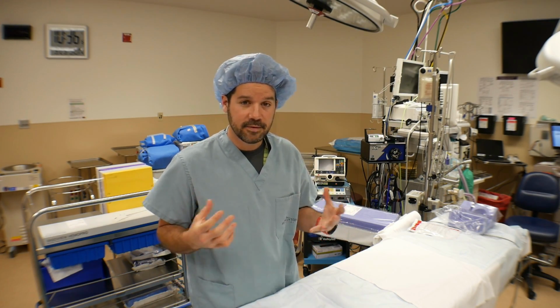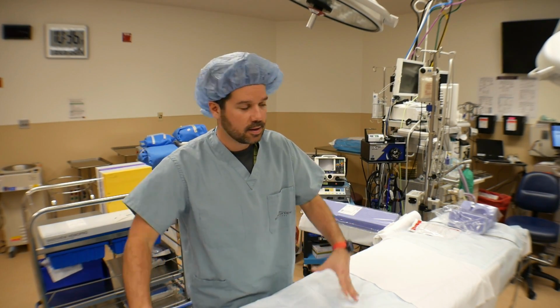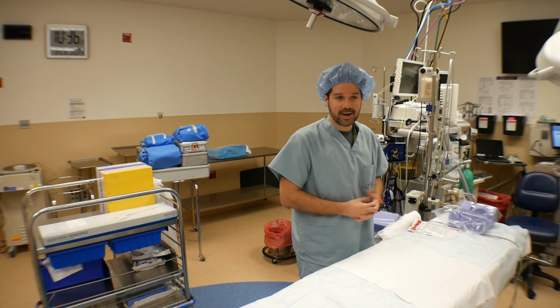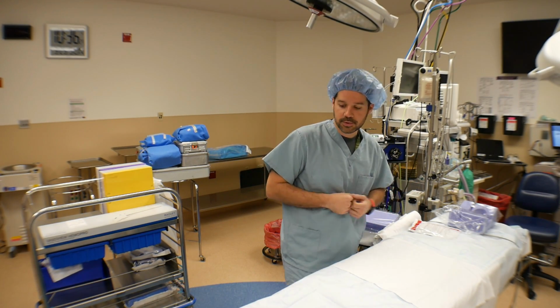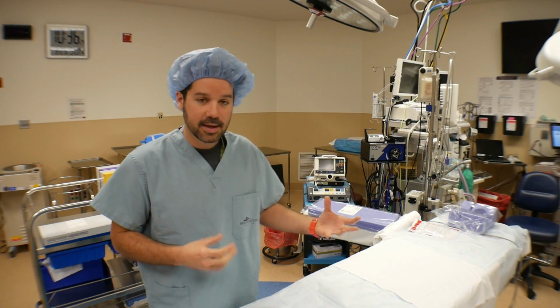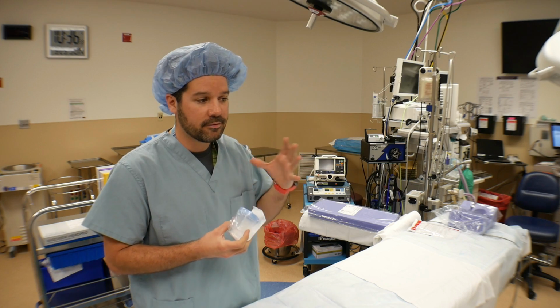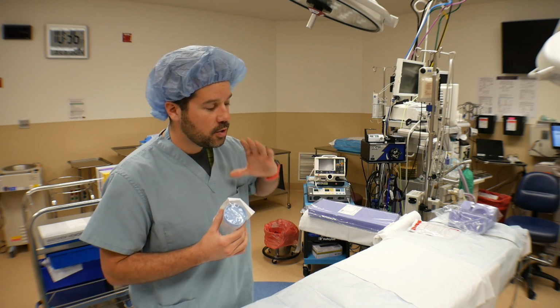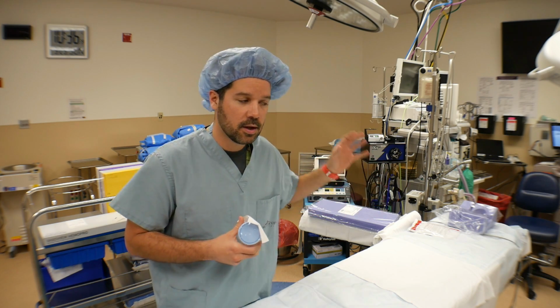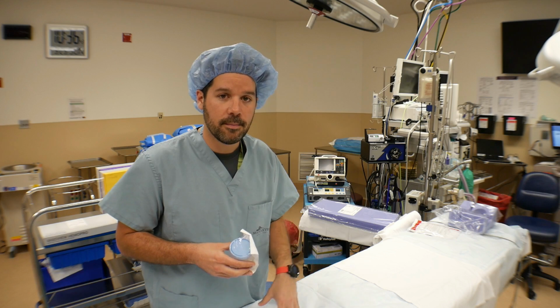Alright, for this last part of the video, I wanted to talk about the surgical tech's role in the specimen. So the surgeon's up at the head of the bed, they excise the piece of tissue, and hand it off to the surgical tech. As the surgical tech takes the tissue specimen and puts it in their cup, or whatever device they have on the field to hand off the specimen with, you have to confirm with the surgeon immediately where this tissue came from.